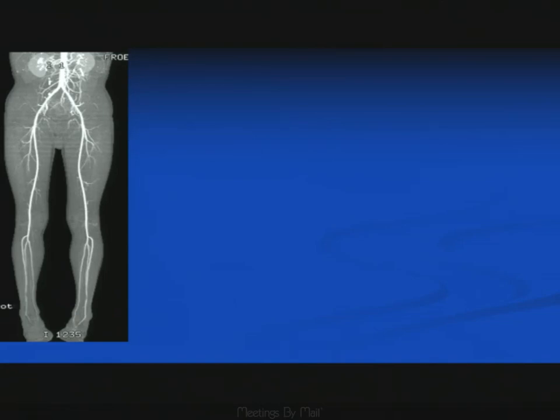And again, it's important, arm up like this, fingers separated. Get the timing right, do the double pass.